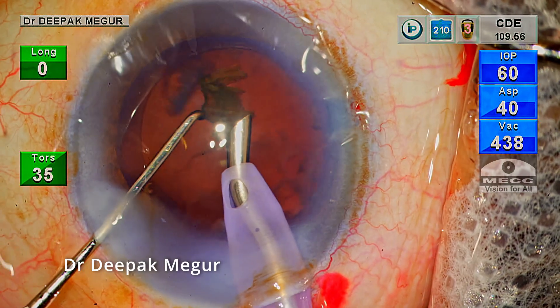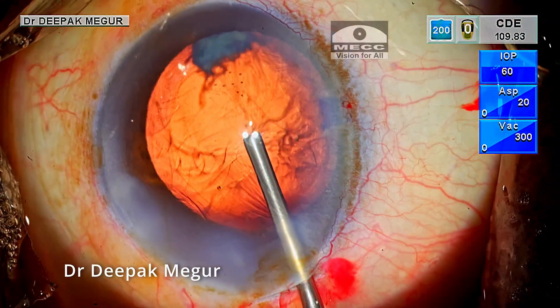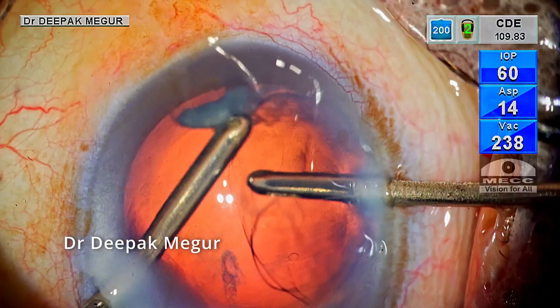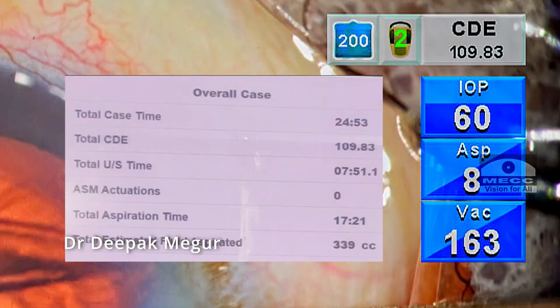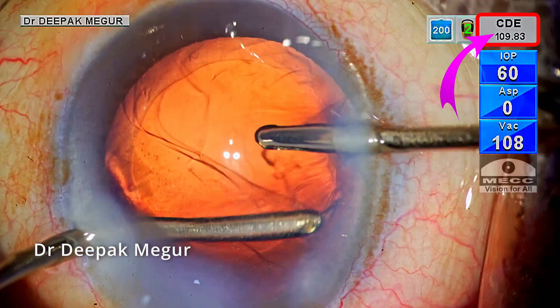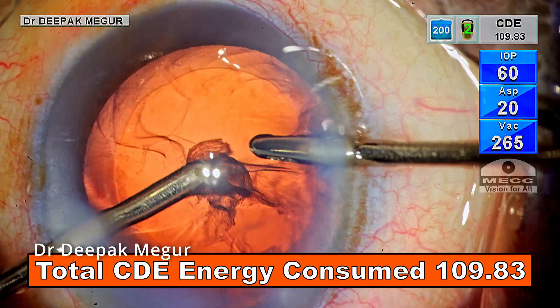Finally, it was done. At the end I can feel that it was not very difficult barring the separation of the two fragments, which was really difficult. Please note the CDE energy consumed — this is almost 10 to 15 times more compared to an average cataract.